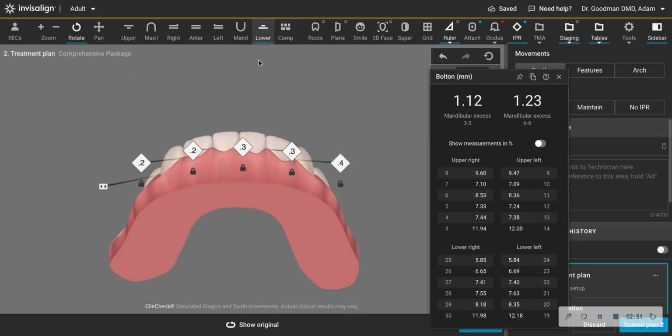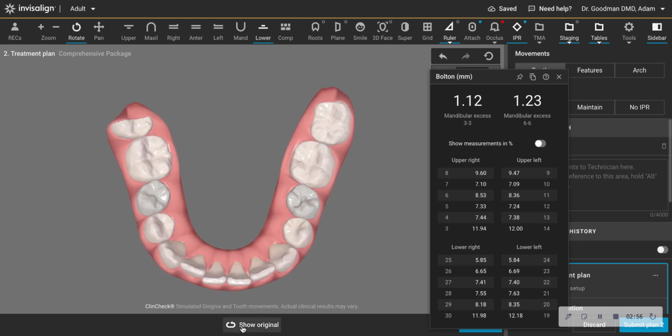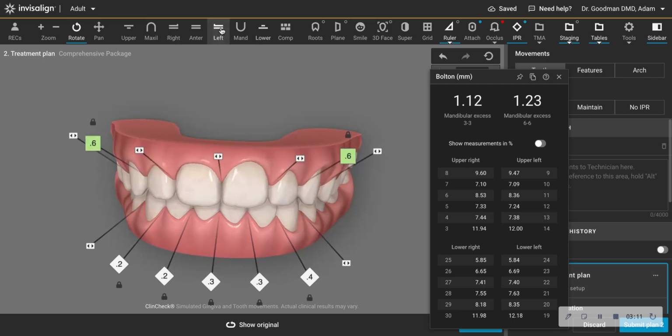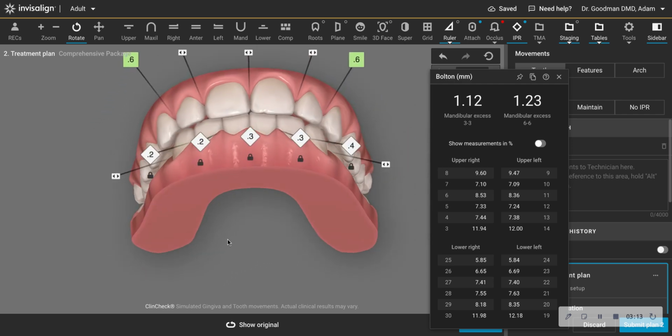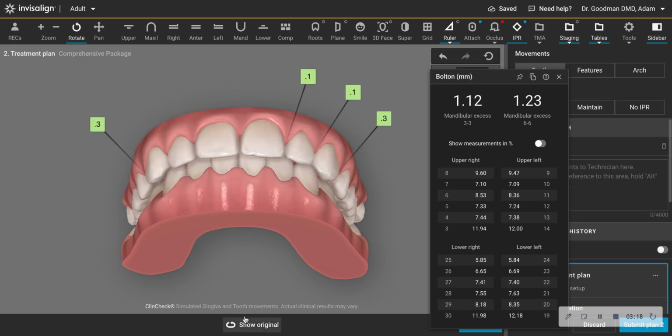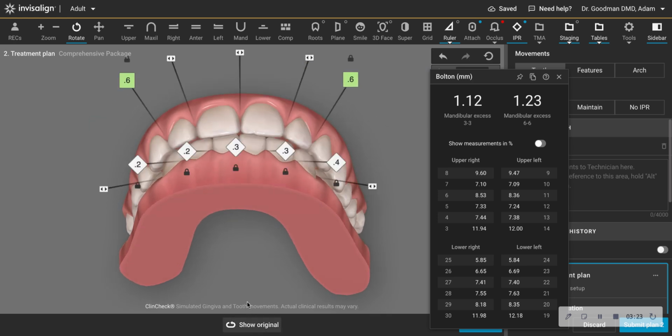absolutely necessary. And to be clear, the amount of crowding that this patient starts out with would not necessarily require any room other than what would happen by the teeth moving into a wider arc. But because of the ratio of this patient's teeth, with the lower teeth being a little wider than the normal ratio as compared to the upper, this patient would have an uncomfortable bite. And when you would do something like Smile Direct or an at-home system that did not know how to measure this, then you end up in a situation where you have a patient with a really uncomfortable bite, and you don't want that.